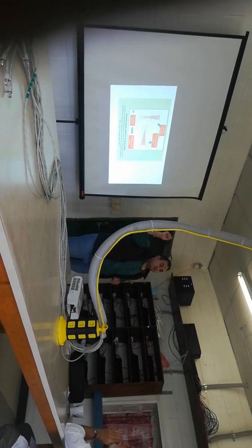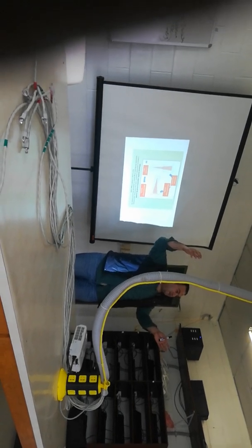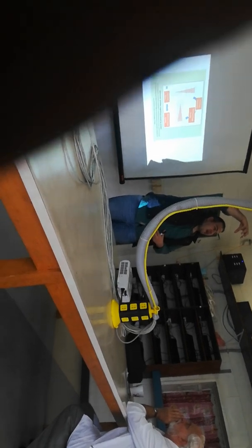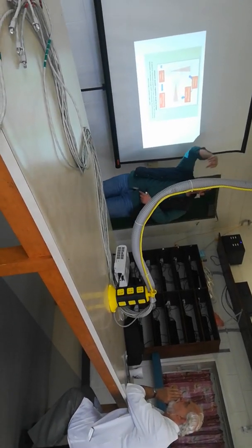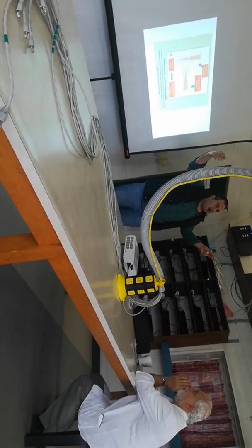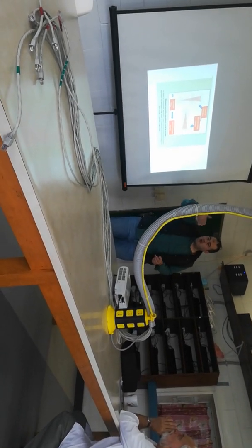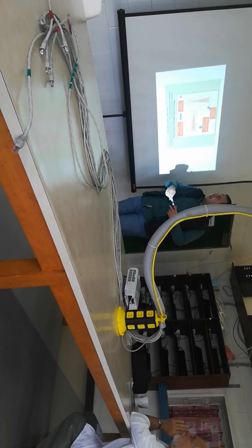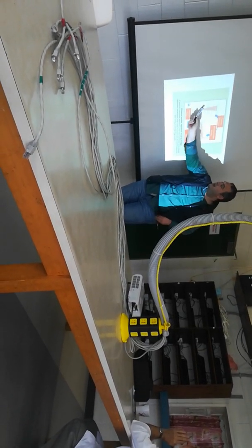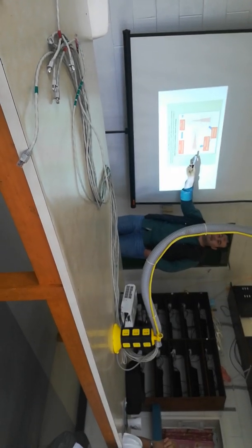Here is the C-arm position and the angle of the C-arm. Sometimes the X-ray tube will be at the bottom and the image intensifier in the up position. But sometimes you will angulate the C-arm to a side position. What's the exposure in the two cases? Here you will find the small exposure when the tube is in the upright position, and in the side position the dose will be increased.